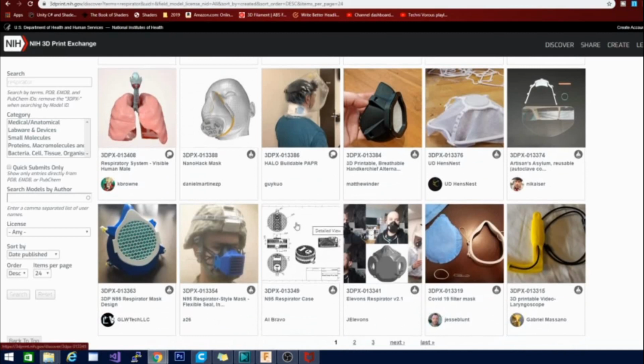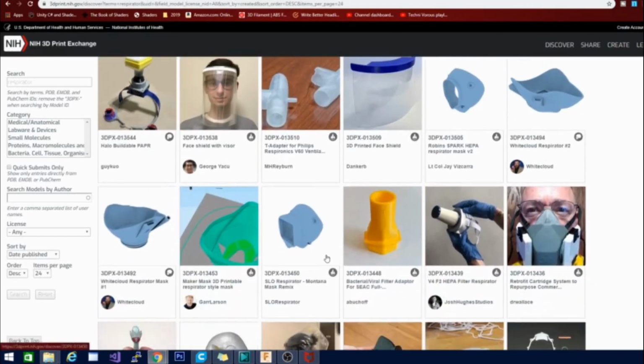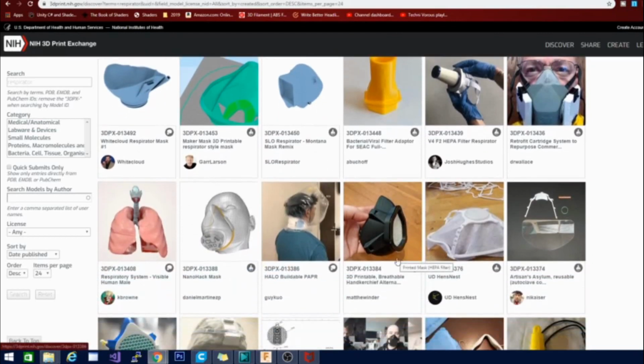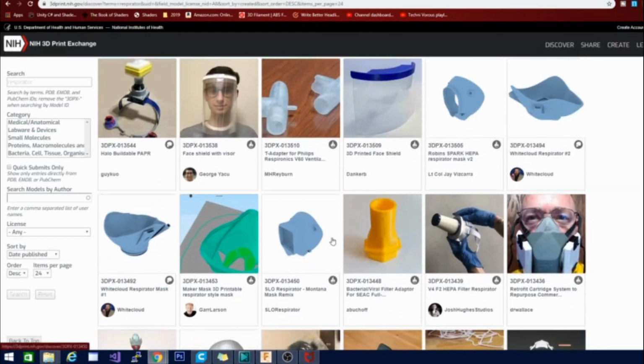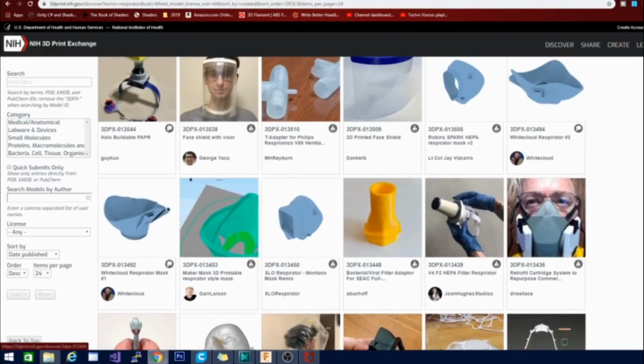Some of them are customizable. This is close to the design that I'm using here, except the one that I'm using also has an outlet for exhaust air. So this is a great place to get examples or prototype STLs to make your own mask, and it will provide you with a lot of different options. Some of them are printed to automatically fit with filters that are made, and some of them are printed to make your own filters out of medical grade air conditioning filters and things like that. So you'll have to read the instructions and pick which one you want.